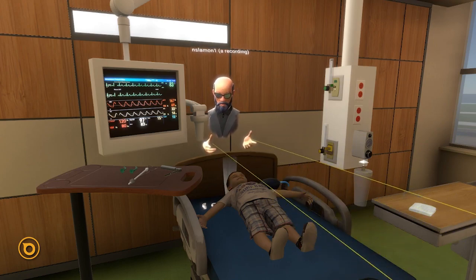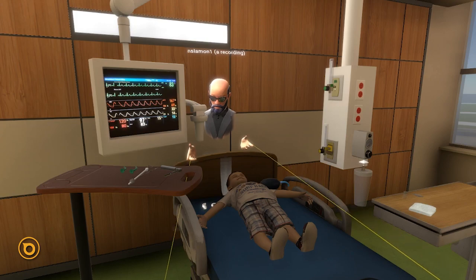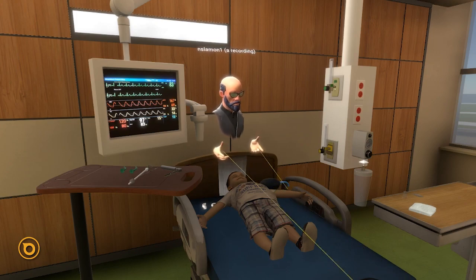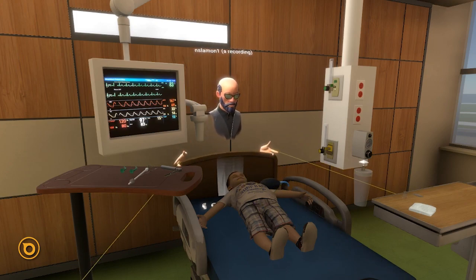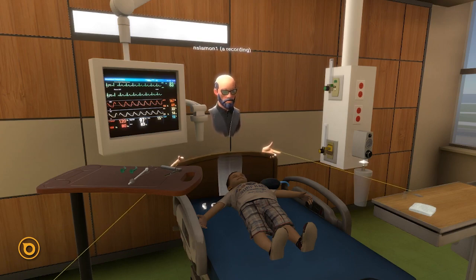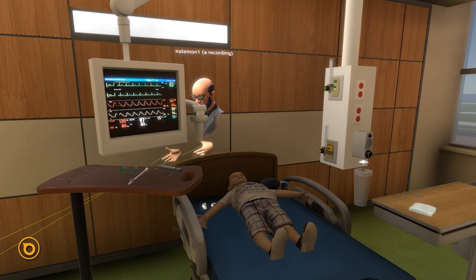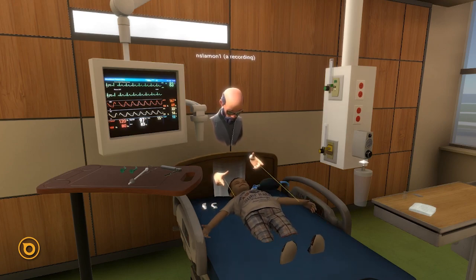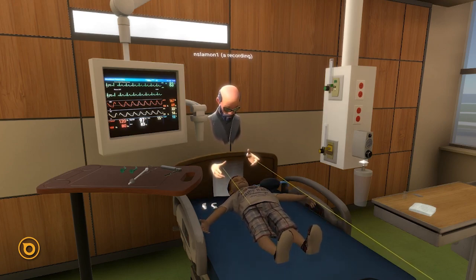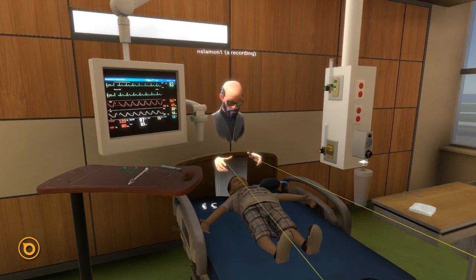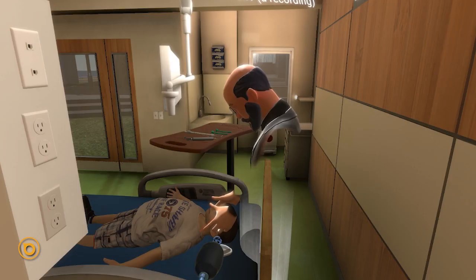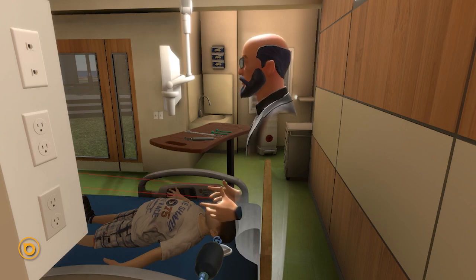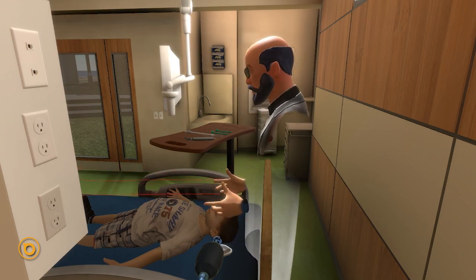Once the patient is properly positioned at the top of the bed, I'll ask the nurses to lower the side rails and the respiratory therapist on my left to lower their side rail so they can get to the patient and help when needed. In many typical PICU beds the headboard is removable, so we'll often take it off and set it aside to directly access the patient. We then place the patient in the head tilt, chin lift — or sniffing — position, using my hands on either side of the patient's cheeks, rotating the head up so they almost look like they're lifting their nose to smell something.